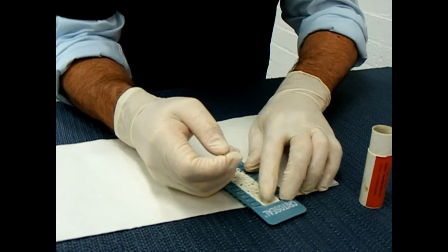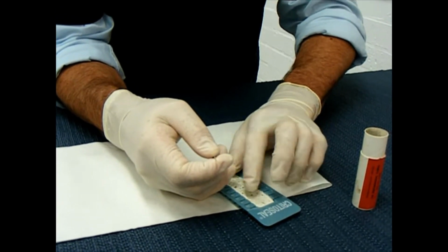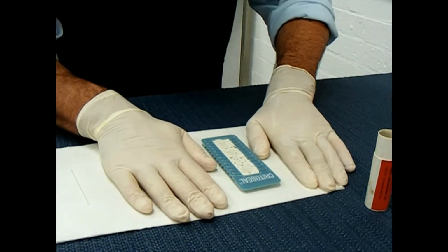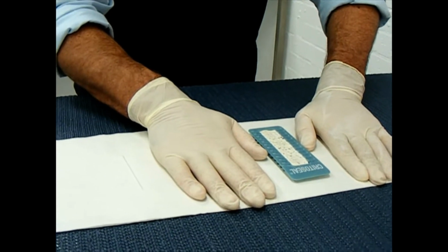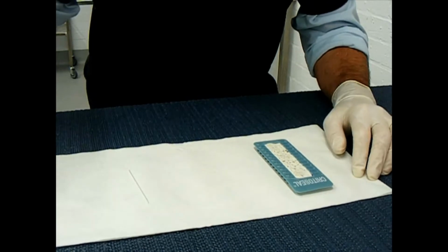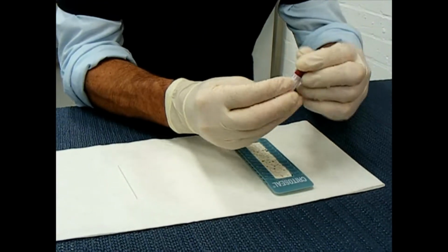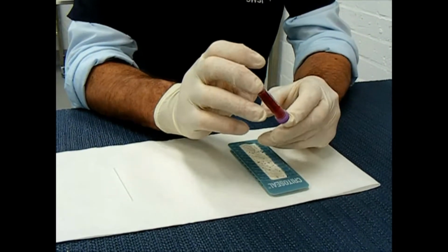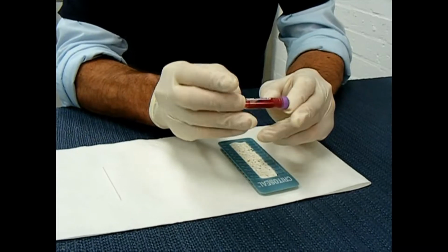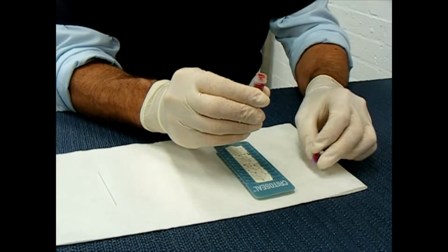So it's a good idea before you start just to squash the plasticine down so you've got some flat areas to work with. You can see I've got a piece of paper here, so I've got a nice clean area to work on. I've got my gloves on, I've got my scrub shirt on, and I've tucked my hair away so I don't drop that in the blood. So first thing, grab your EDTA tube and you rock it gently back and forth to make sure it's mixed properly. So when we take the sample with the capillary tube, it's even, it's a representative sample.